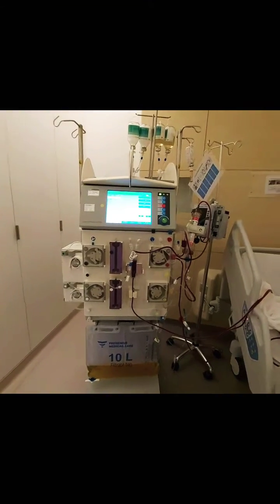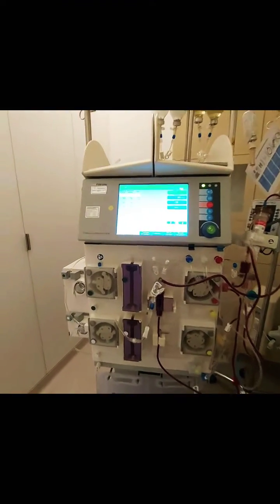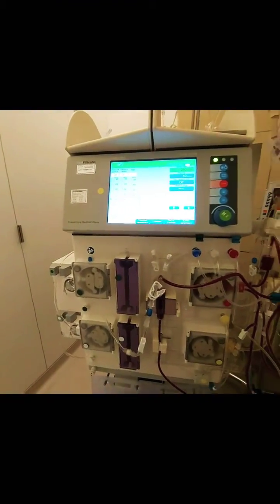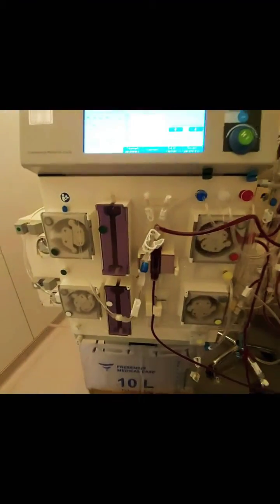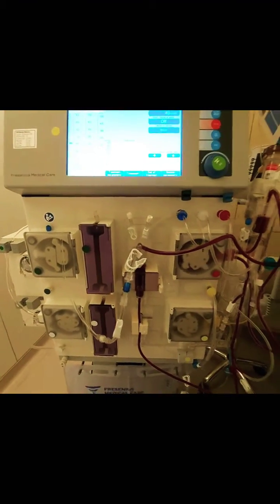It's a four-pump machine, and while performing plasma exchange, it's only three pumps which will be in use.